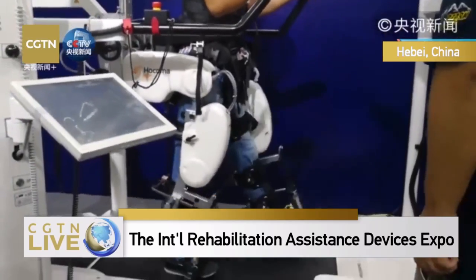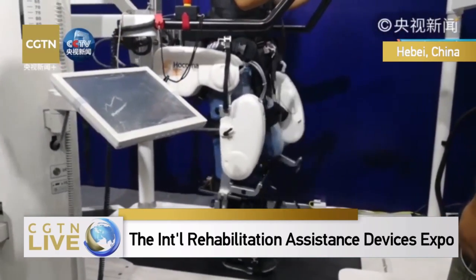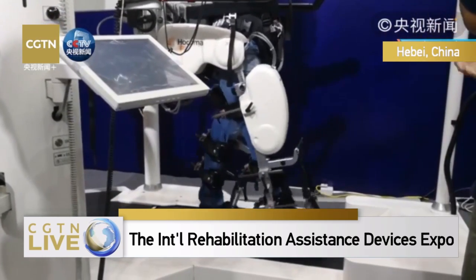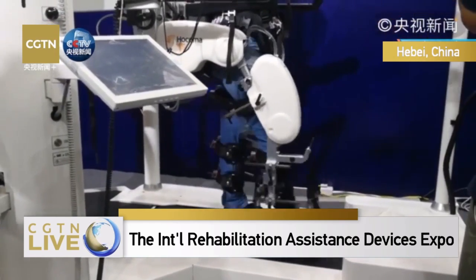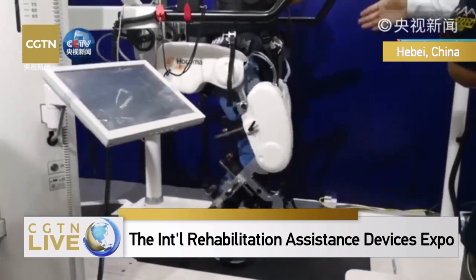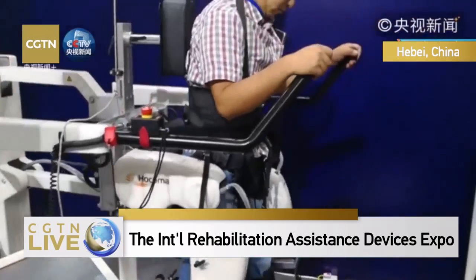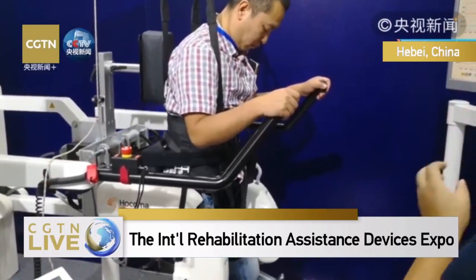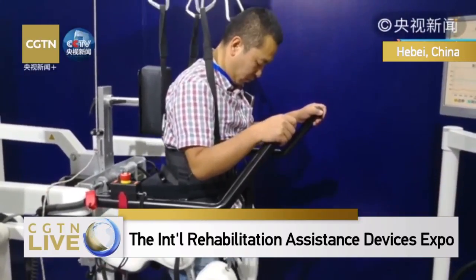It's a mimic of humans' walking posture. It can also reduce body weight for someone. For normal people, their center will move up and down like this.